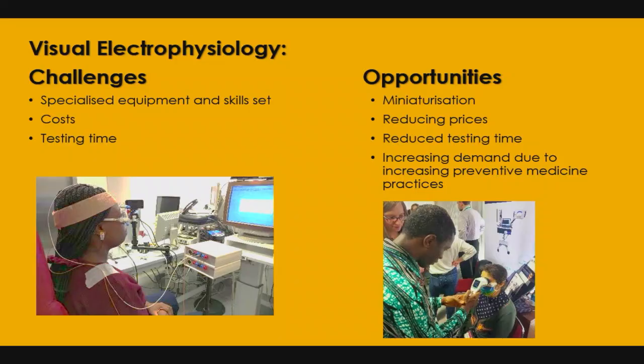And so this is the kit that is in Freiburg. You need specialized equipment. I showed you this just to show how it has developed. Sven, how old is this kit now? 20 years plus. But now we have moved on to handheld versions.